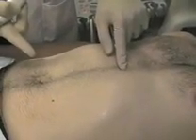Here's a video clip to further review the ultrasonic exam of the abdominal aorta. Recall the surface anatomy of the abdominal aorta, and we can pick it up just at the area of the subxiphoid process of the sternum. And there's going to be about the level of bifurcation into the paired iliac arteries at about the level of the umbilicus. So generally a good starting point is going to be just below the subxiphoid process.